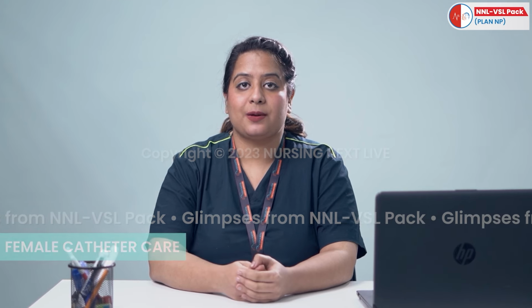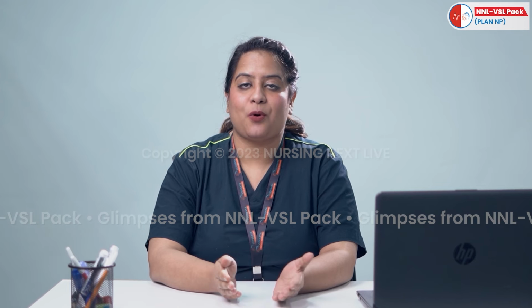In this video, a nurse will understand the various aspects of female catheter care, steps of procedure, equipment required, after care, and most importantly, what to do when things go wrong. In other words, common clinical errors.